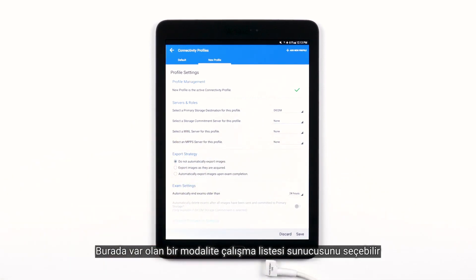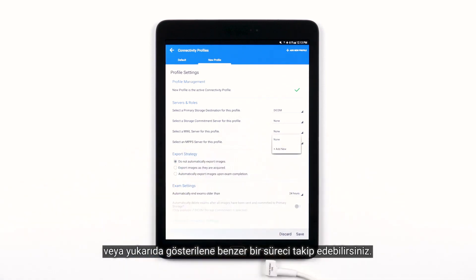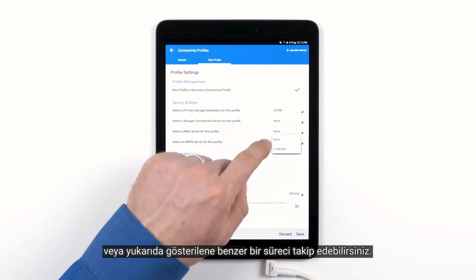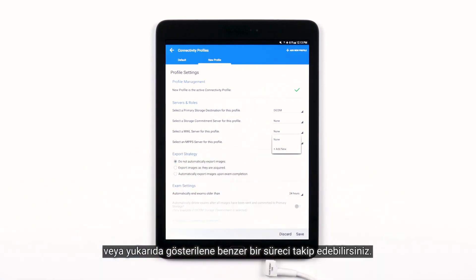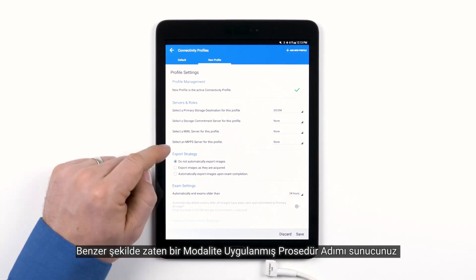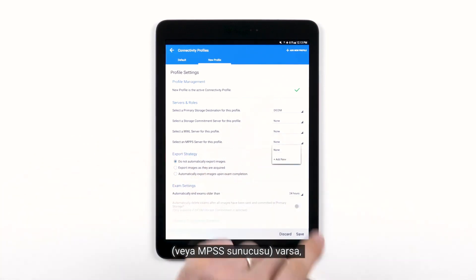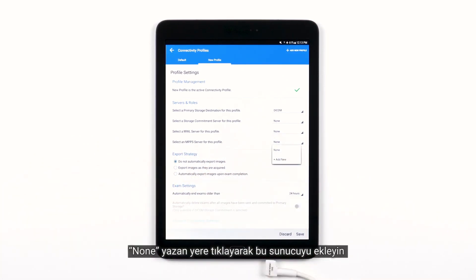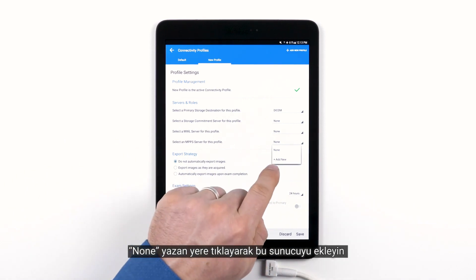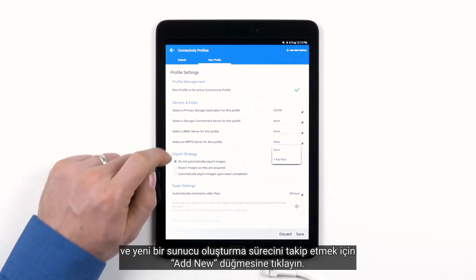This is where you will select an existing modality worklist server or set up a new one through a similar process as shown before. Similarly, if you have an existing modality perform procedure step server, or MPPS server, add that server by tapping where it says None and tap Add New to walk through the process to set up a new one.